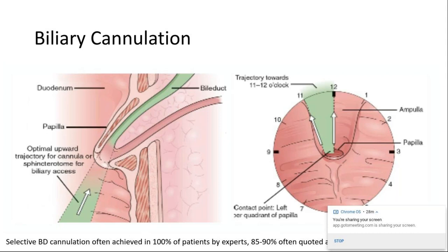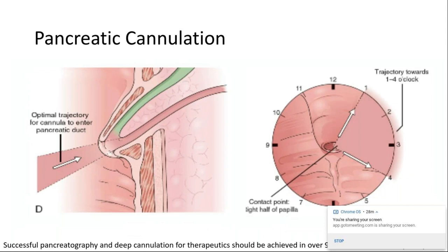Suction will collapse the duodenum and pull the papilla closer to you, while air insufflation will push it away. And during attempted cannulation, you want to lock the control wheels to allow fine adjustment of the scope tip and avoid any recoil while adjusting controls. However, you have to make sure you take those locks off if you're going to do any excessive repositioning. Next slide.